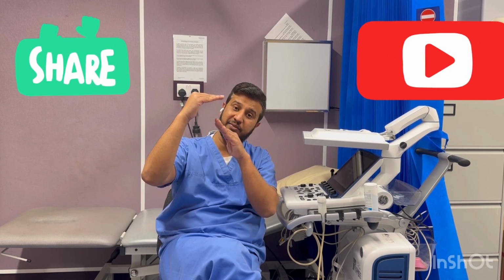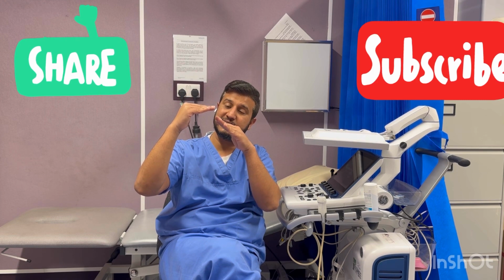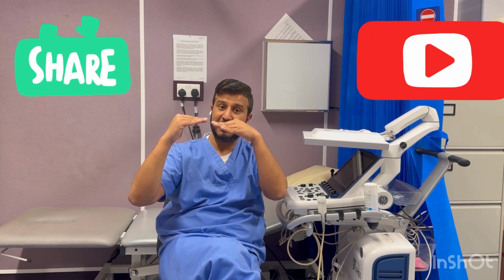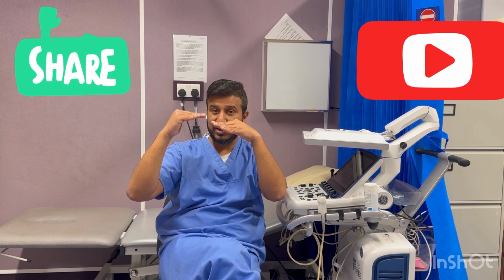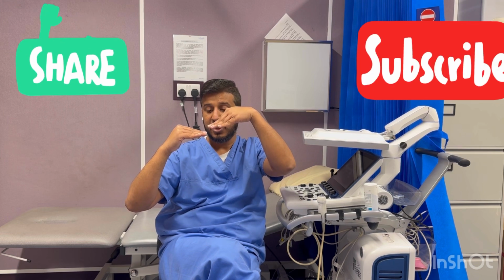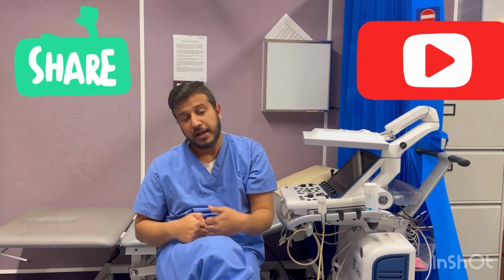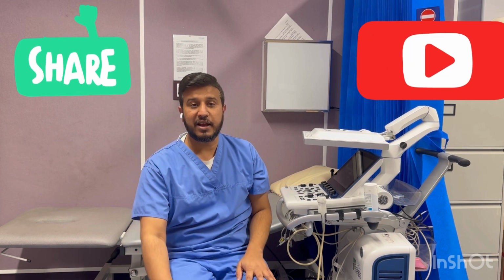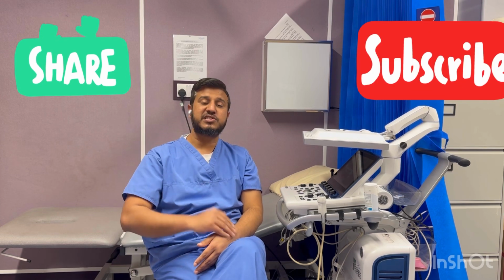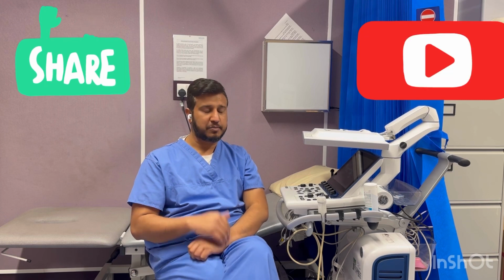Okay, so once you are going to get the pulmonic valve, your tail will be this way. Okay, so you can get the views. Then you come onto the aortic valve, so your tail will come like this. Then you come onto the mitral valve, so your tail will be like this. Then you need to see the apex, so your tail will be like this. In most of the patients, you don't get the apical level in the same position, so you need to go one space down from your imaging plane, so you can get the better apical imaging.